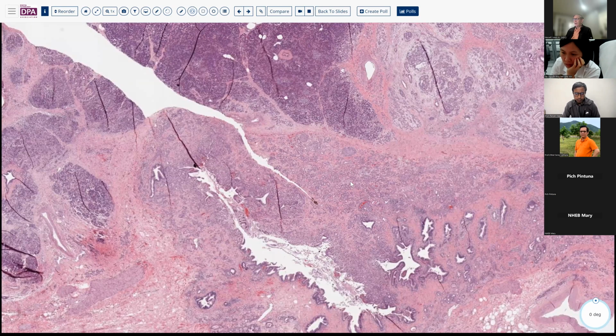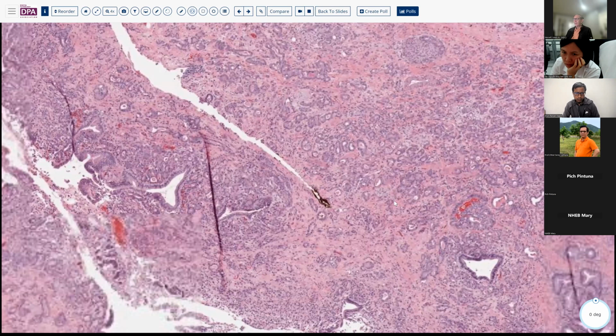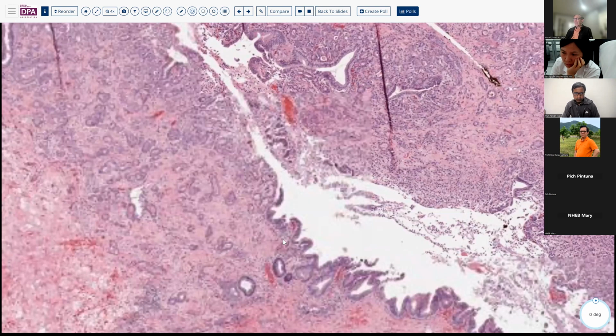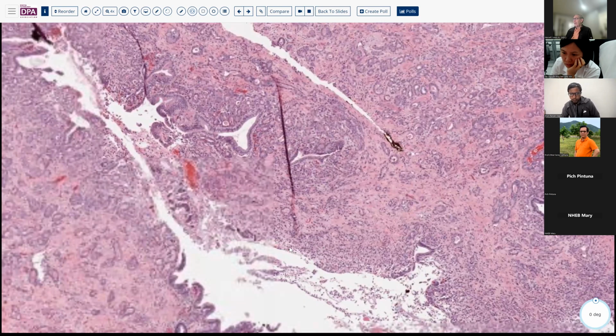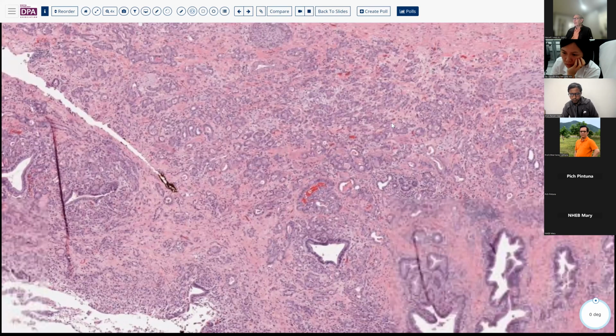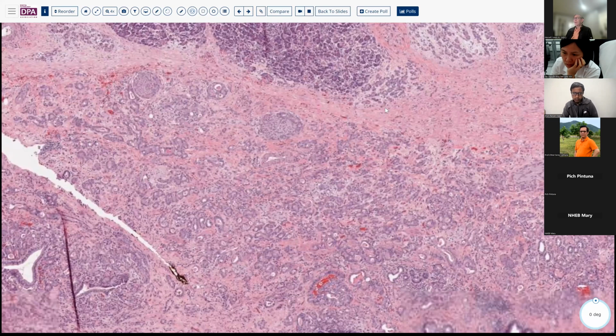And I think we can see here it's extending into the bile duct and the main pancreatic duct, causing some ulceration here as well. So a little bit of a subtle type of pattern that in its pseudolobular architecture can mimic just kind of degenerating acini. But this is just way too cellular here in the tissues to be residual acini. And then you have the control tissue.